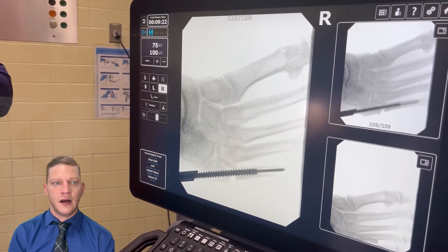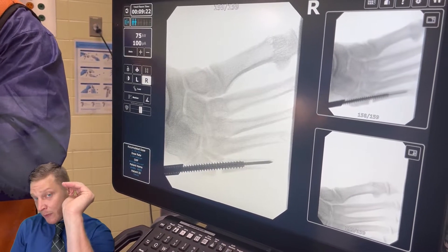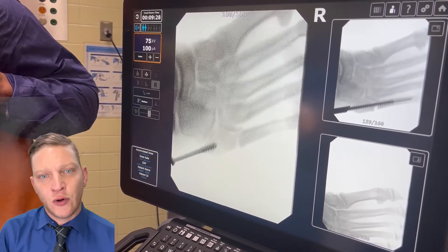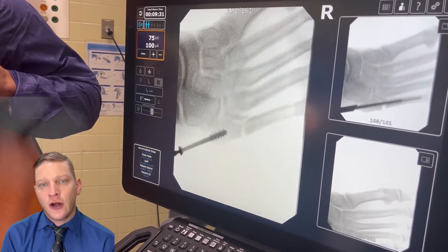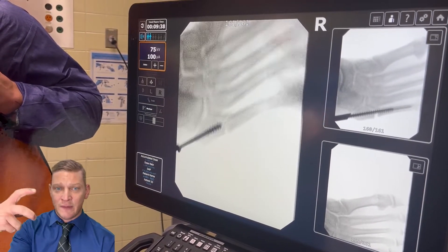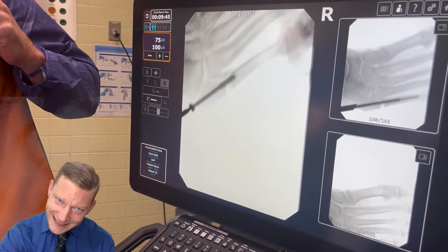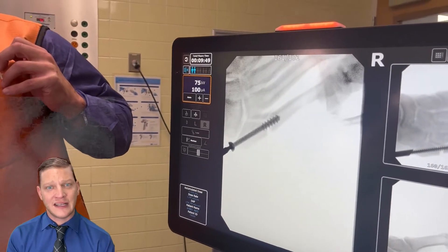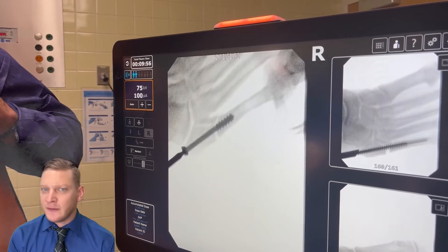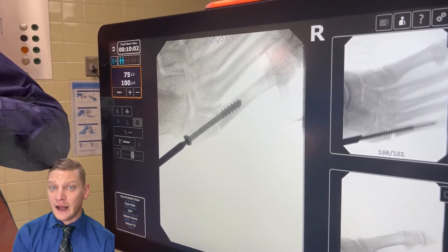Some of these young men have harder bone than older women. A lot of the procedures I perform are on older women — bunions, hammer toes — and their bone is relatively soft. We're tapping this bone in preparation for the screw. What you saw on the x-ray that looked like a screw is actually the tap — it's carving out the inner part of the bone for the screw to eventually fill in. We then use something called Augment, which is a platelet-derived growth factor recombinated from bacteria using human DNA to make PDGF, placed in a calcium-based compound vehicle at the fracture and screw site to promote healing.